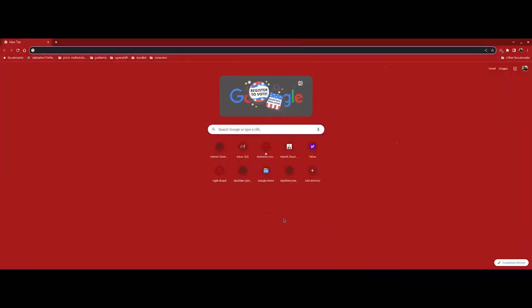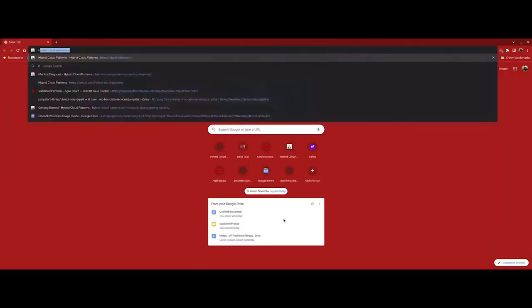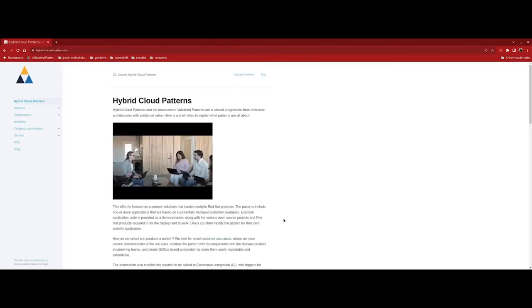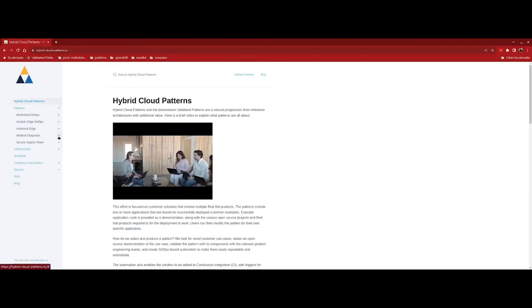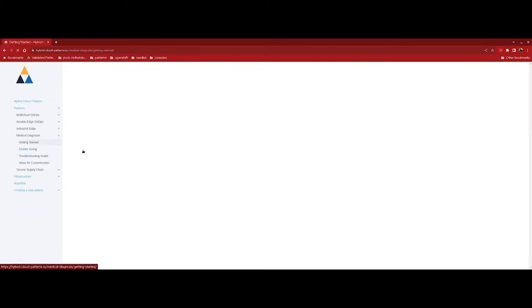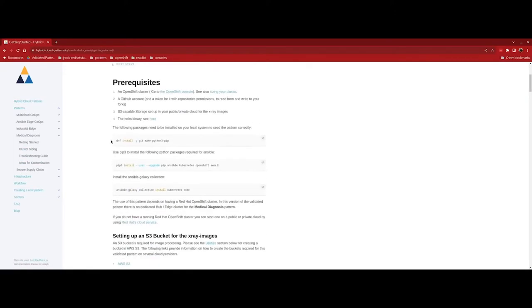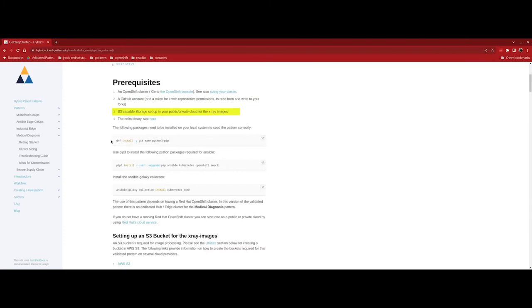To get started, let's open a new window and browse to https://hybrid-cloud-patterns.io. On the left hand navigation menu, we'll find the drop down for patterns, then medical diagnosis, and then let's click getting started. The first prerequisite that we have is that we must have an OpenShift cluster. Next, you'll need your own GitHub account, and you'll need an S3 storage service available within your public or private cloud to host the x-ray images.